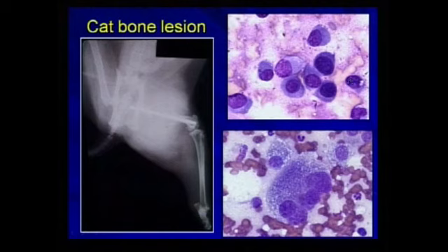No, not really, so it's not inflammatory. I think we can rule out osteomyelitis, and the cells are fairly monomorphic. But as you travel around this slide, you come across this large multinucleated cell. And the cells have some vacuoles. There's one neutrophil here, but there's blood, so you have to consider the possibility of peripheral blood or a bloody tap.